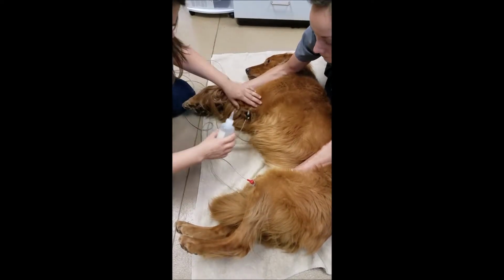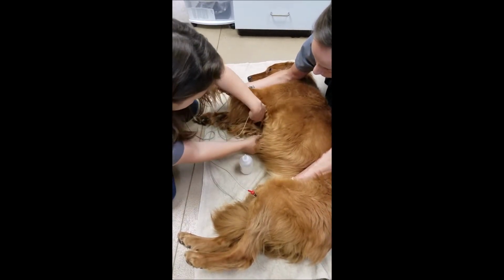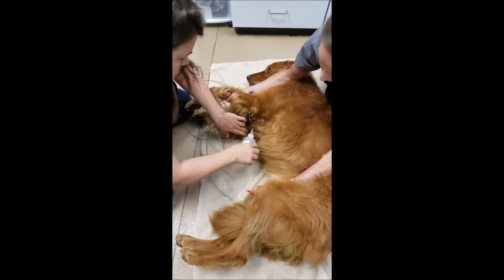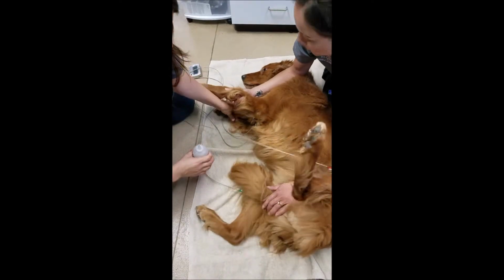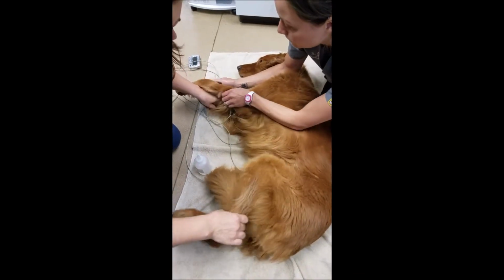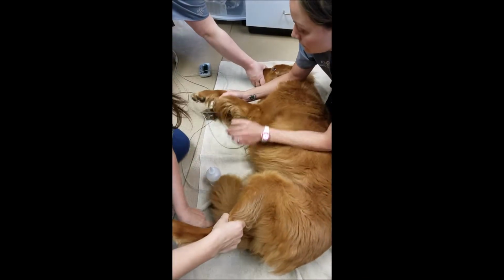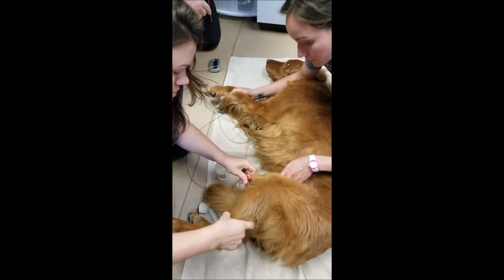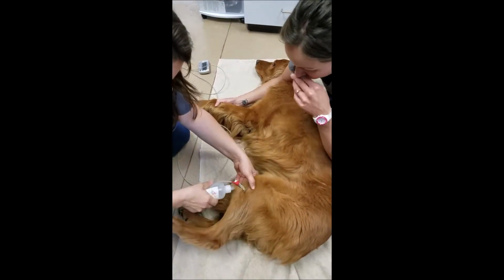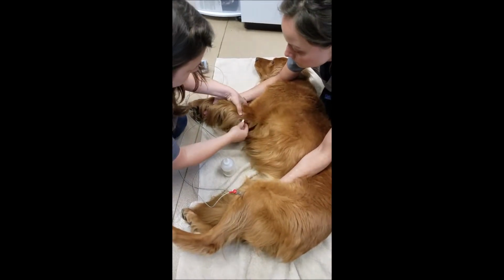Okay, so now we can soak them in alcohol. Okay, he's moving a little bit, so I might have to make some adjustments here. Okay, so I'll just reattach these here. That's looking good. Okay, let me just, after he moves, make sure that these are all still attached.